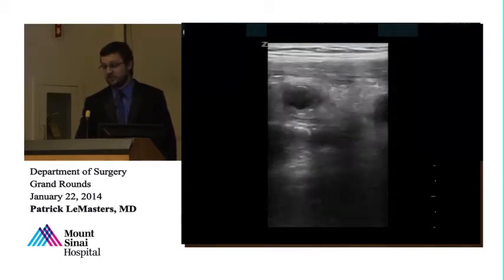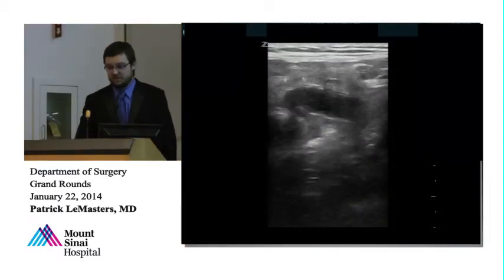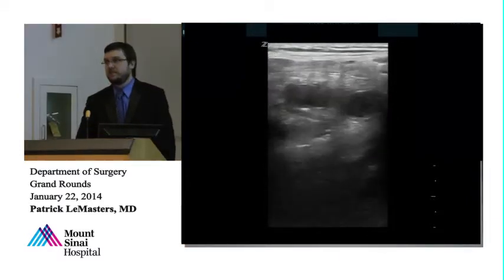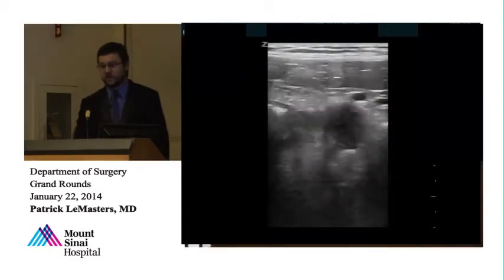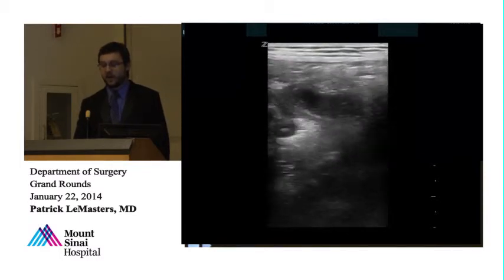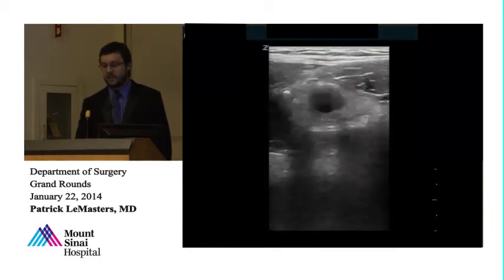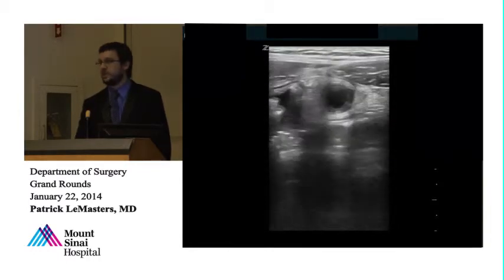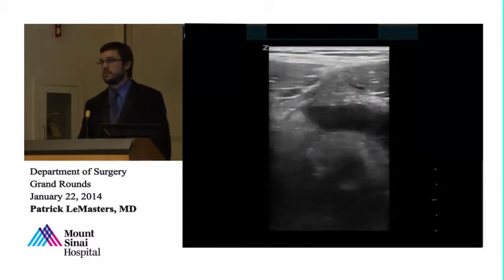You're like, what am I looking at? What do you want to do with that? What's your interpretation of this? What's your plan? Let's look at it again. What if I told you this is the structure we're looking at? This is a tubular structure. It's in the right lower quadrant. It's going down. It's blind ending. It looks dilated. When you push on this area, the patient has a lot of pain there. Their white count's 11.